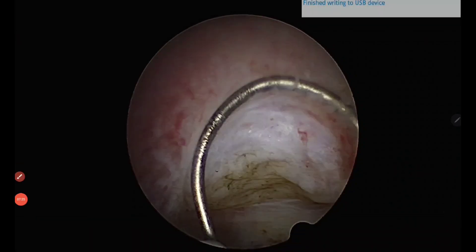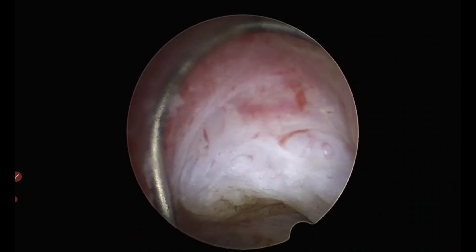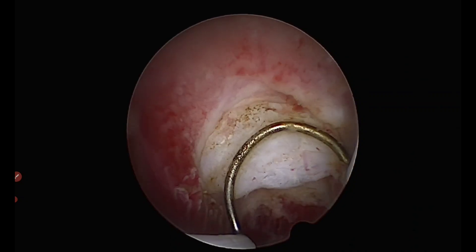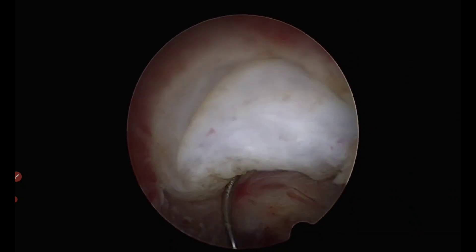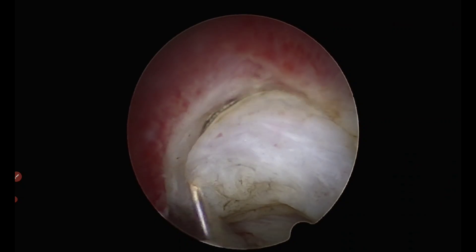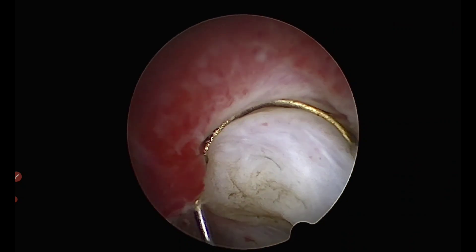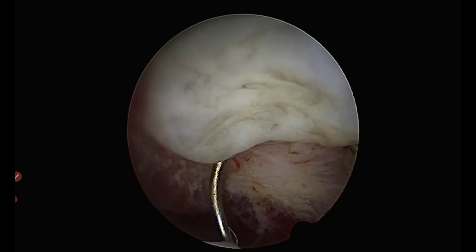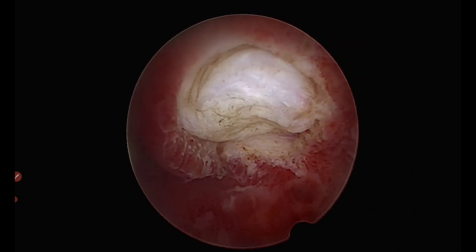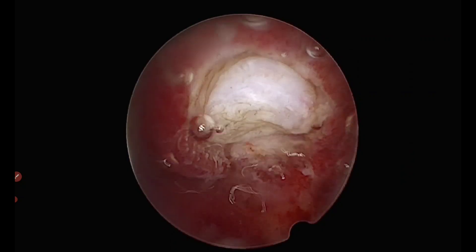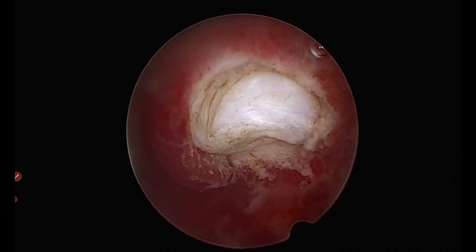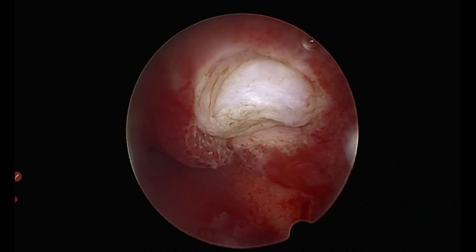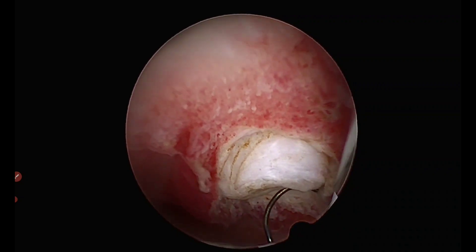With successive reductions in pressure you can see how the fibroid bulges into the uterine cavity. At the height of the bulge, I isolate the fibroid from the underlying myometrium and give a small burst of current — the fibroid starts bulging into the endometrial cavity. The loop is placed over the fibroid with a gentle push toward the cranial end and a very short millisecond burst of energy. This technique of reducing and increasing distension pressure is called Hamos massage, which forces the fibroid to bulge inside as the myometrial fibers behind squeeze it into the cavity.